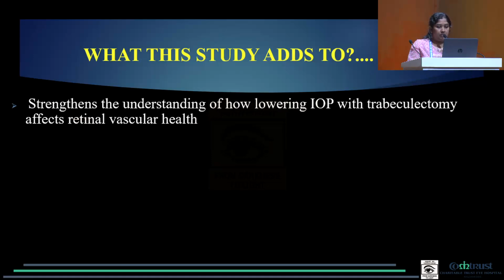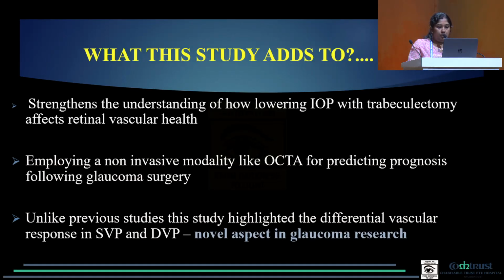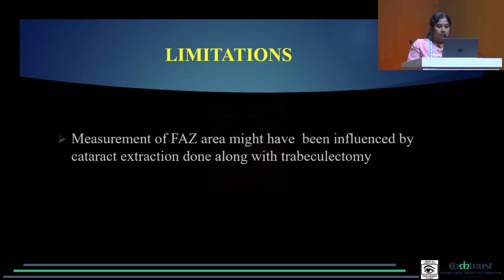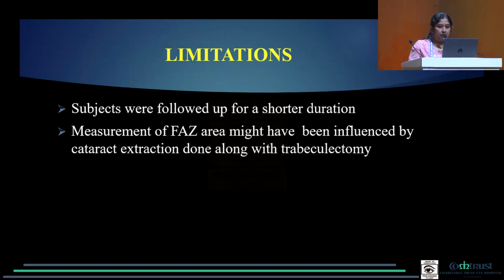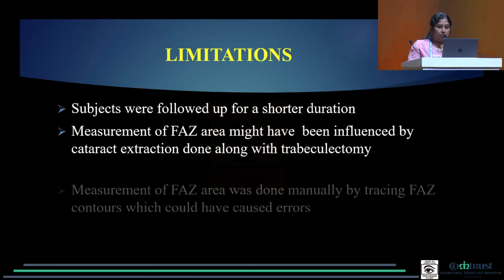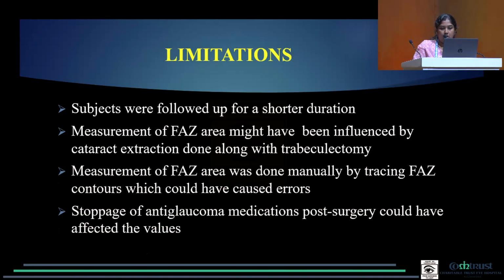So the study strengthens the understanding of how lowering IOP with trabeculectomy affects retinal vascular health by employing a non-invasive modality, and it also highlighted the differential vascular response in SVP and DVP. The values might have been influenced by cataract extraction done along with trabeculectomy, and patients were followed for a shorter duration, and FAZ area was manually traced. And stoppage of anti-glaucoma medication post-surgery could have also affected the values.